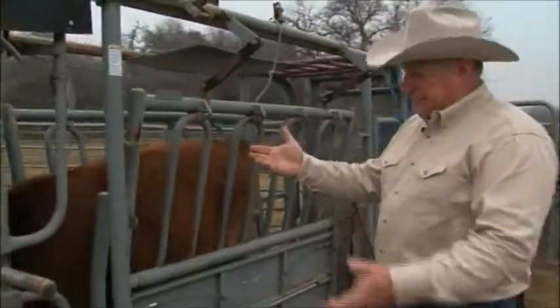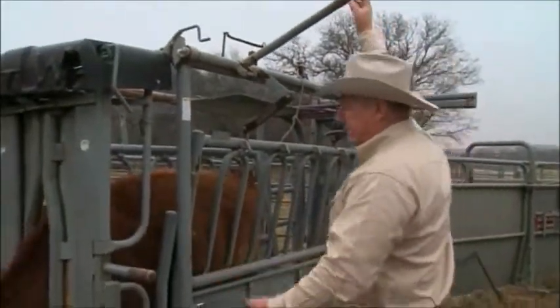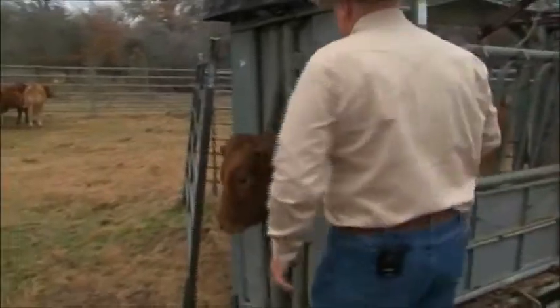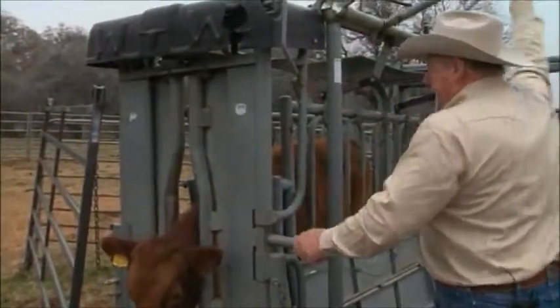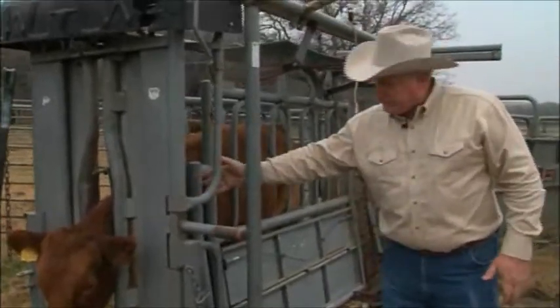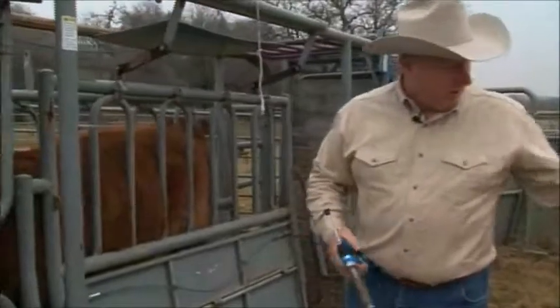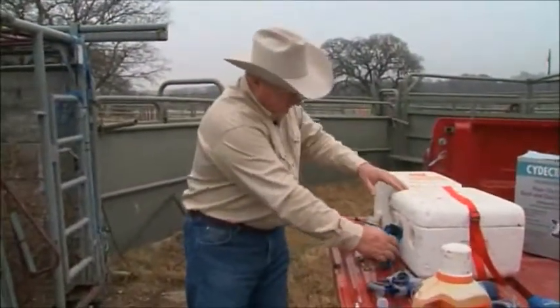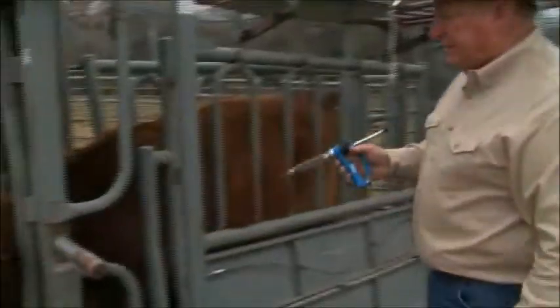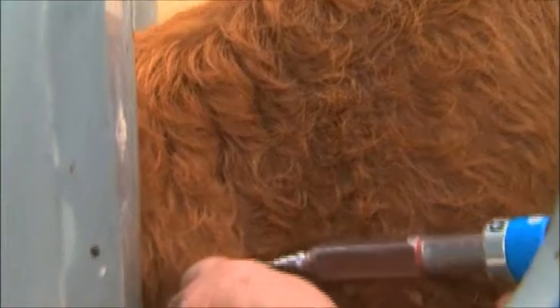Like cattle in a self-catch head gate, or if you have somebody helping you, that works great. I like to let the cattle come in. If they will, step back. Squeeze the cattle down, and that gives a very good open area on this side of the neck. Take your syringe, and as you come out of the box, that's why I like this cooler. You can pull that syringe out very easily, come to the neck, and I like to tent the skin.